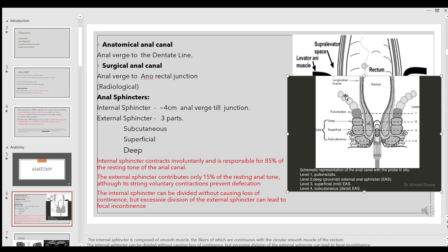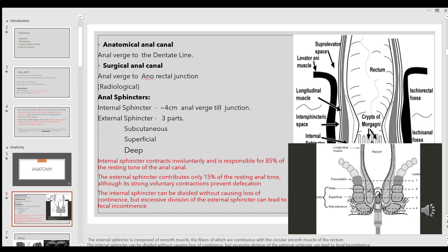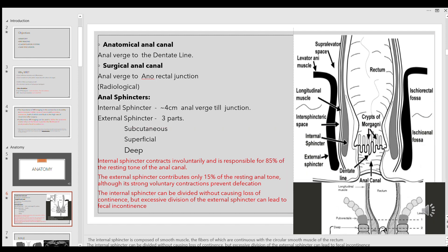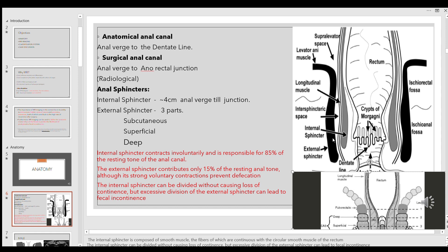The external sphincter then continues as levator ani. In my reports, I always mention the internal sphincter and the external sphincter complex. I will either mention the external sphincter separately in relation to the puborectalis muscle and levator ani, or mention it as the external sphincter complex — depending upon the complexity of the track.